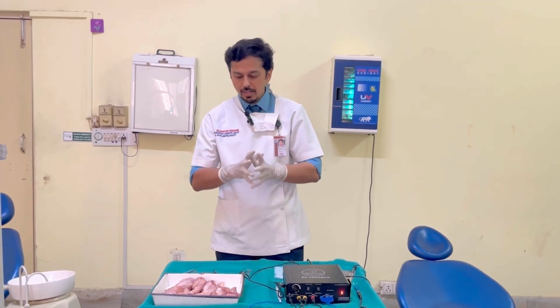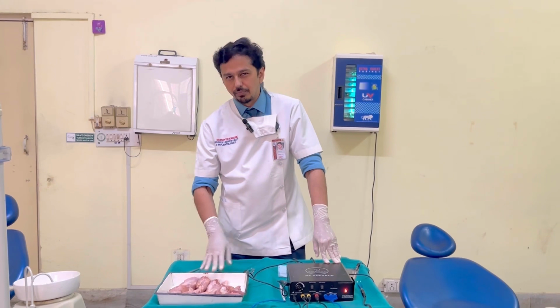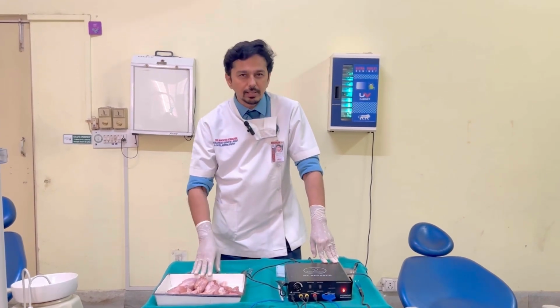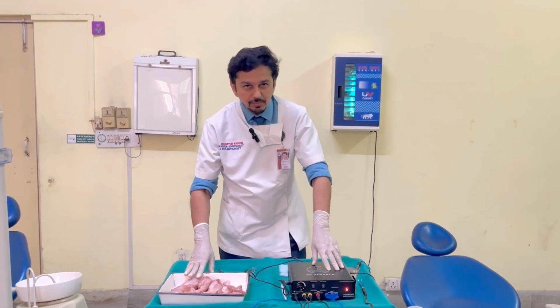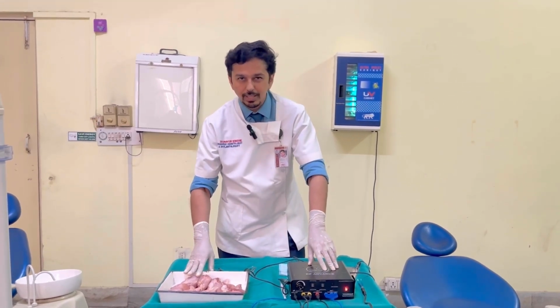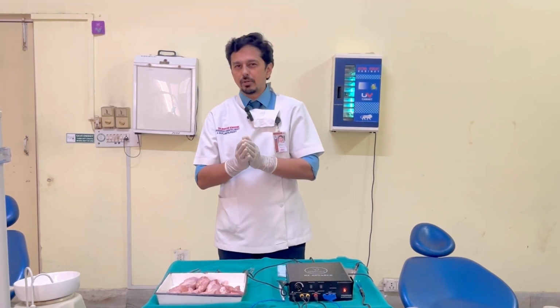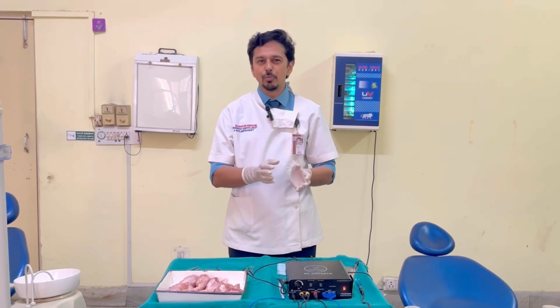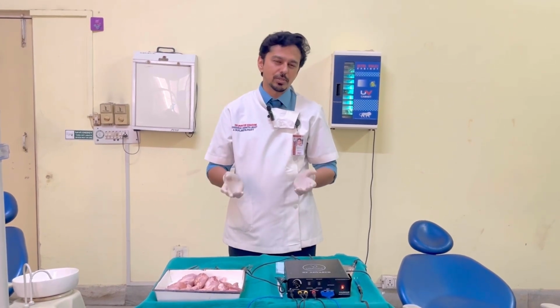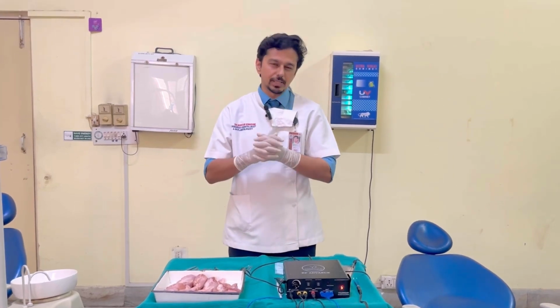For example, if you want to do initial preclinical training of these procedures, I would highly recommend doing it on an animal model first, especially with regard to a thermal modality like electrosurgery, because cutting with electrosurgery is like cutting of butter with a hot knife. If you let it sink, it touches bone and bone necrosis might be there. So always practice first on an animal model. That would be my suggestion.